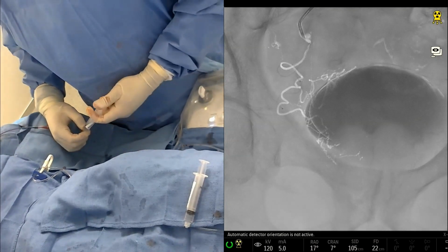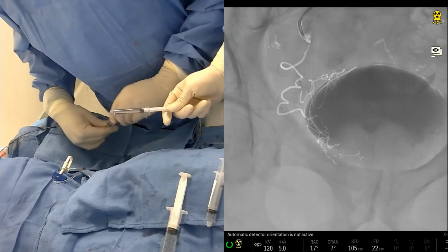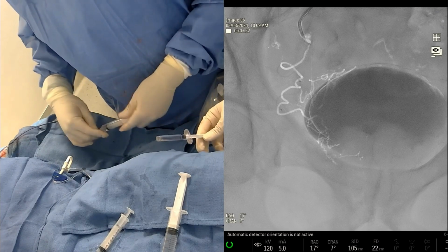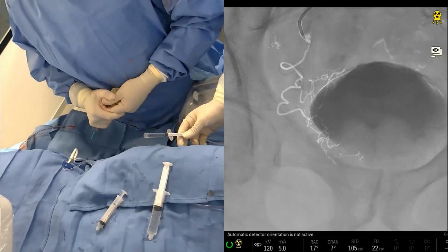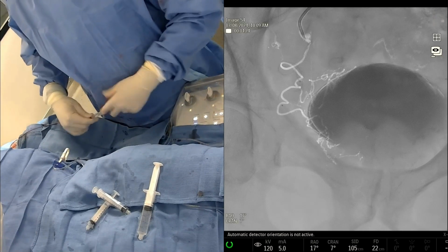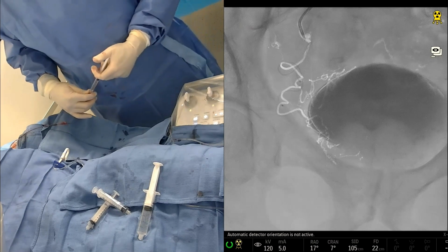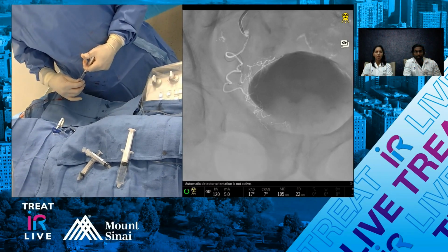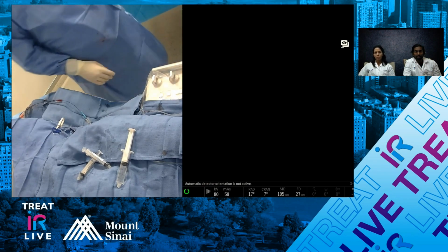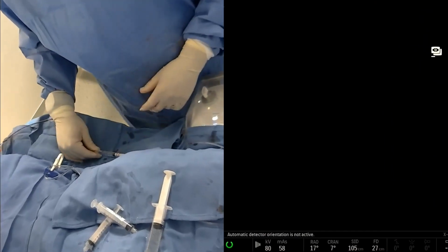Yeah, the True Select has really been a game changer for prostate, I think. Especially the angle tip. Some people have their opinions about angle tips, but I really like it for this. It actually may be hurting us here. Here's some saline. How much nitro and verapamil do you usually give in these direct installations? Usually every time we inject, it's about 200 of nitro and 2.5 of verapamil. So I usually have at least 1,000 ready and about 10 of verapamil.